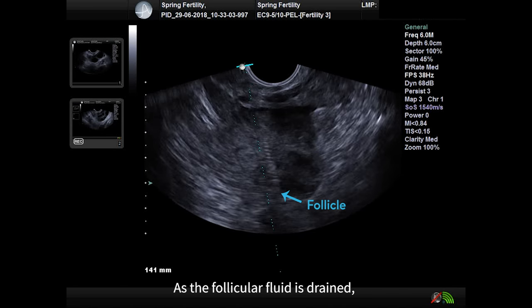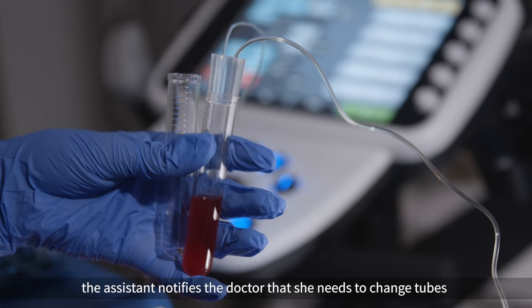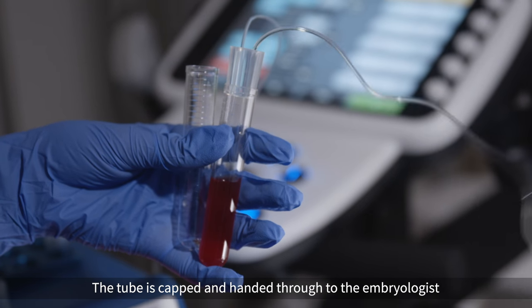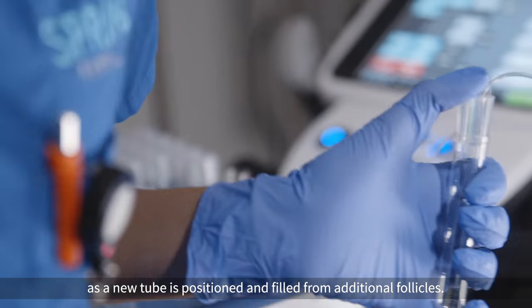As the follicular fluid is drained, it accumulates in test tubes. Once a test tube is nearly full, the assistant notifies the doctor that she needs to change tubes and the doctor will wait before moving follicles. The tube is capped and handed through to the embryologist as a new tube is positioned and being filled from additional follicles.